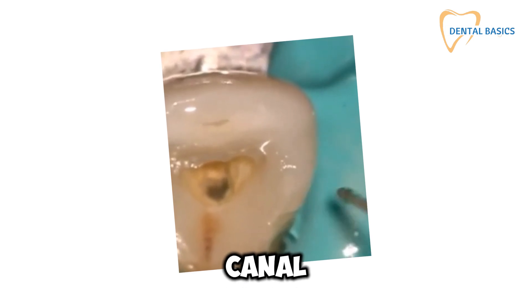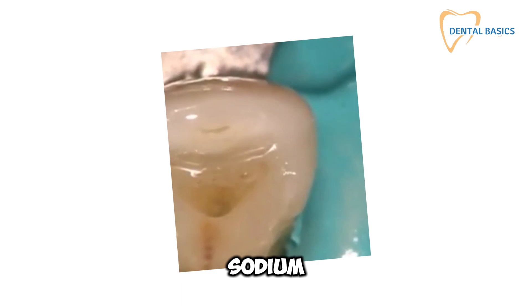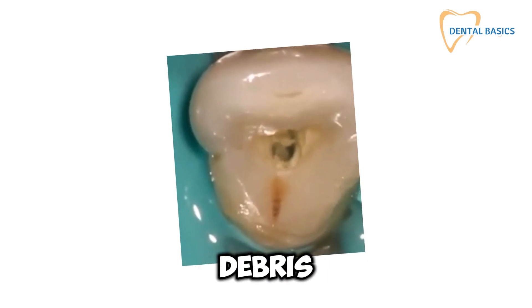Now, on to canal disinfection and debridement. Use a combination of sodium hypochlorite and EDTA, and don't forget the gentle instrumentation to clear out any remaining debris. A clean canal is the foundation for successful apexification.